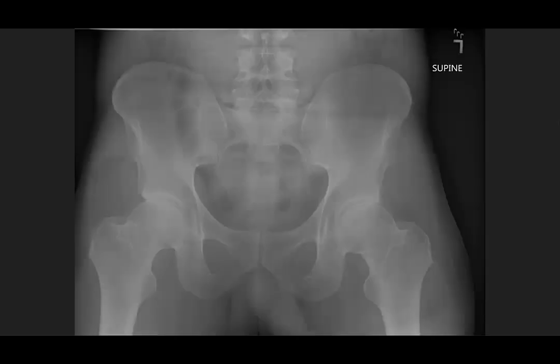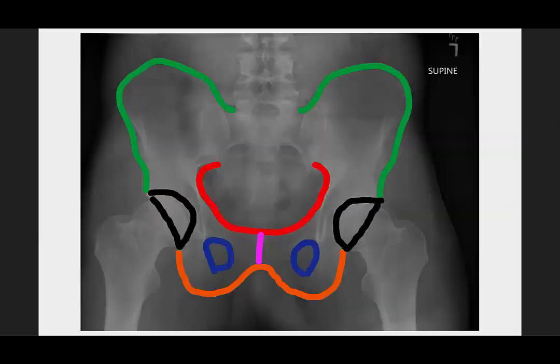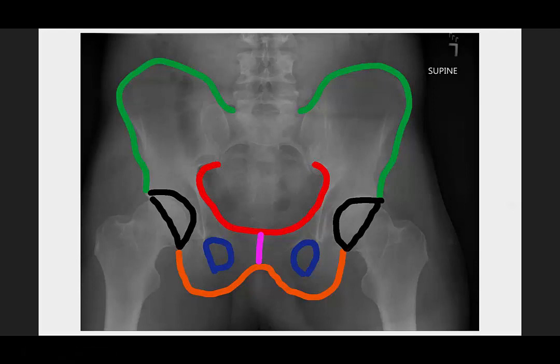We're talking AP plain films of the pelvis in the setting of trauma. Reading a pelvis film can be analogous to my art skills — just stay inside the lines. You can think of your pelvis in terms of three rings: your larger main inner pelvic ring, and the two smaller rings made up by the rami.